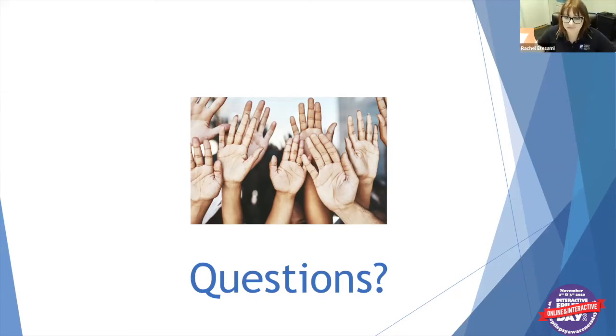But we also find we can get helpful information from the ambulatory EEGs if we just, for example, want a seizure count, to confirm someone who has absence seizures and is treated on medications, and parents say, yeah, we think they are not having any seizures anymore. Sometimes having 24 hours of recording to just confirm that, and you don't need the video to see it because you can just see, did they have any seizures on EEG in 24 hours? Then they don't have to stay in the hospital for that. And so that's a common reason we'll also do it.